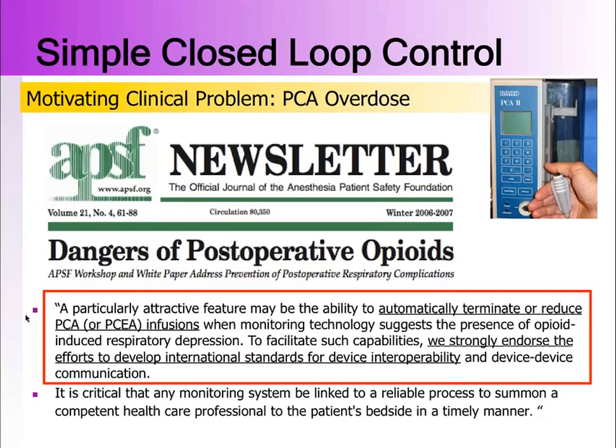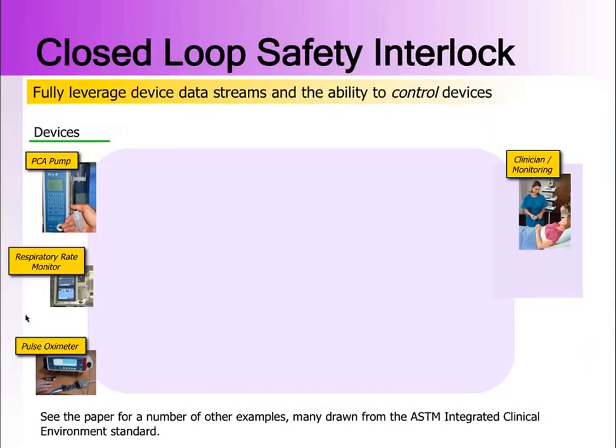Now, this is something that as systems engineers is blindingly obvious to us. You've got the sensors there. Right now, the clinician would have to look at that and say, oh, something is not going well, now let me walk over and turn off the pump or change the flow rate of the pump and so forth. And it's just a simple matter of trying to stitch these things together if you had some sort of platform that would allow you to do that.